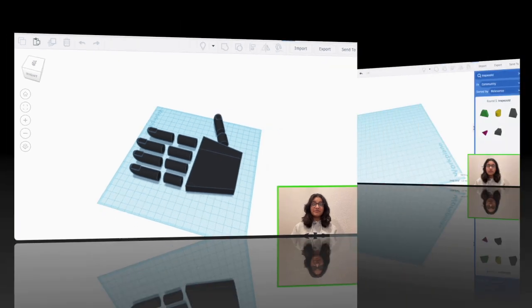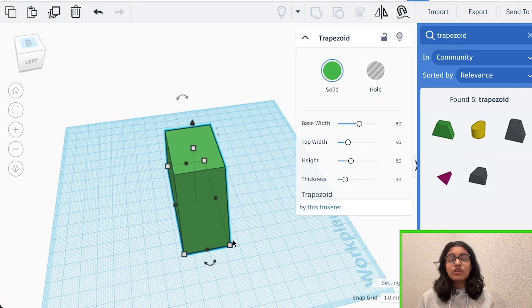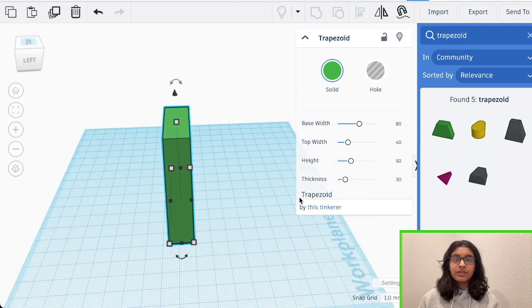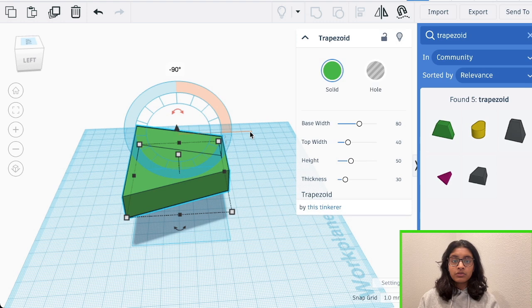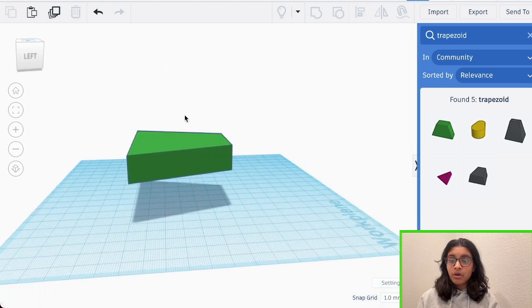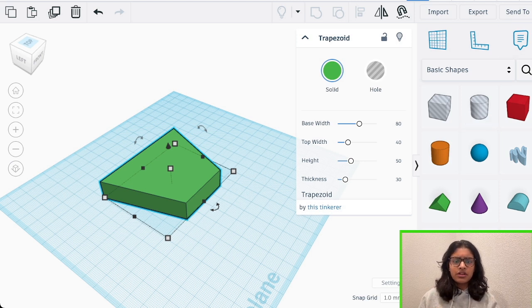So let's get started. We're going to begin with making the palm of our hand. To make this palm, we're going to be using a simple trapezoidal shape that TinkerCAD already has in its basic shapes. So you can go to the search bar and search up trapezoid and go to the first option. After dragging the trapezoid to your work plane, give it the dimensions of 15 by 61 by 79 millimeters. After editing your trapezoid's dimensions, turn it over 90 degrees with the arrows provided and bring it down to the bottom of your workspace. Now this will serve as an incredibly simplified version of our palm.